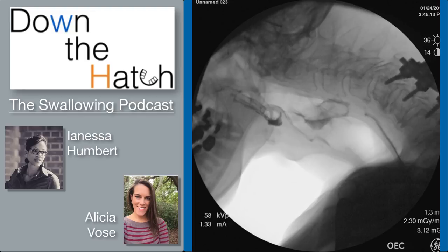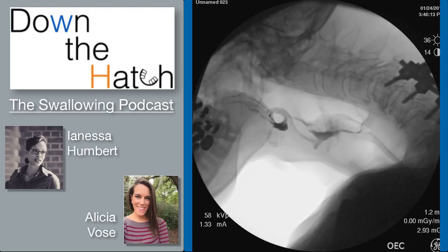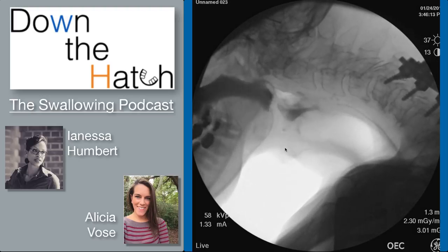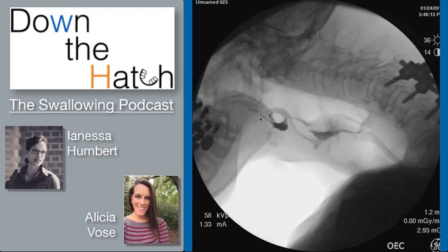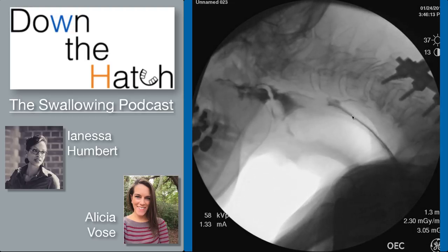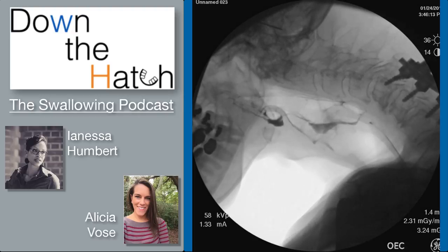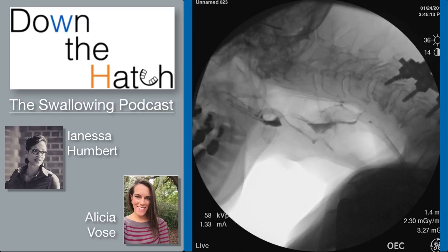Moving to horizontal is a very minimal amount. Let's work on breaking down epiglottic inversion — we know it's multifactorial. Are there issues with airway protection? There's some evidence in what we saw that there was likely airway invasion, and that definitely looks like it's below the vocal folds. Something happened before the swallow — we're jumping in midway. There's evidence of residue, and this is pretty difficult to get out because gravity is not on this person's side. We can say both bolus efficiency and airway protection could be a factor, and one obvious thing to point out is that there is not complete epiglottic inversion.